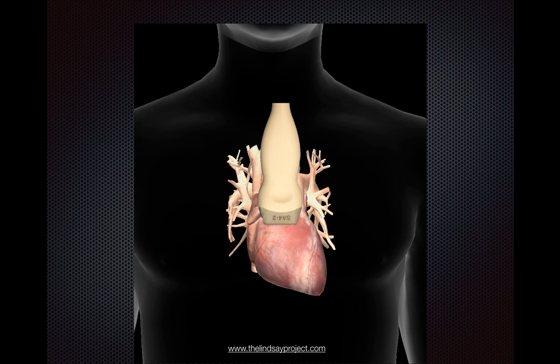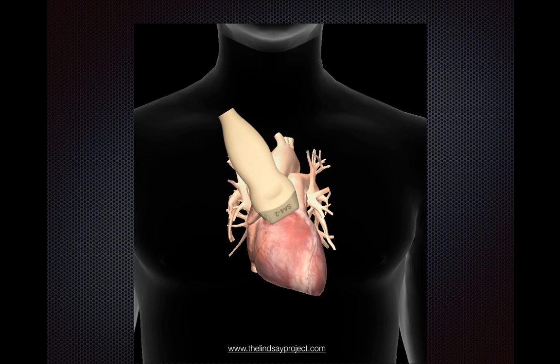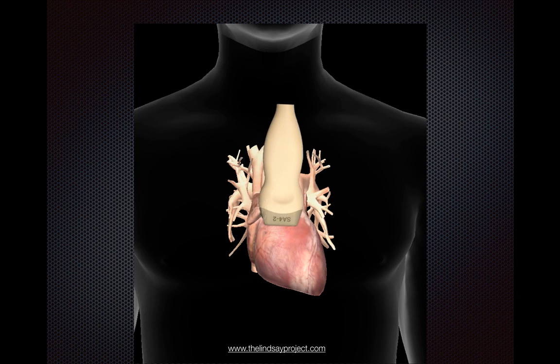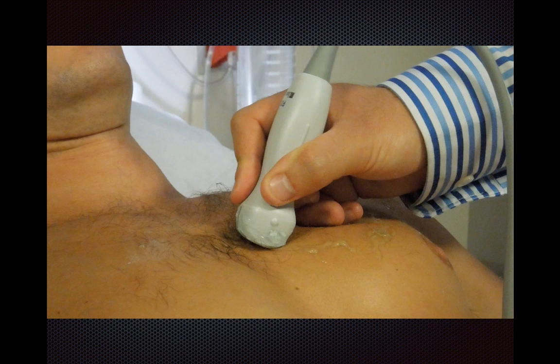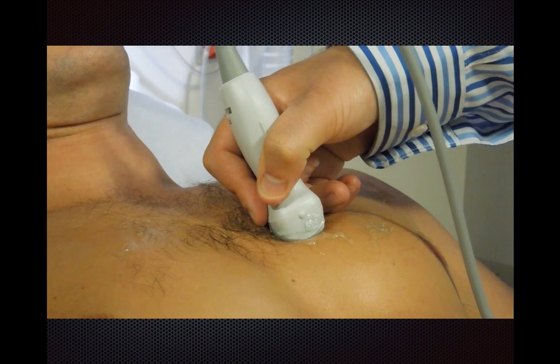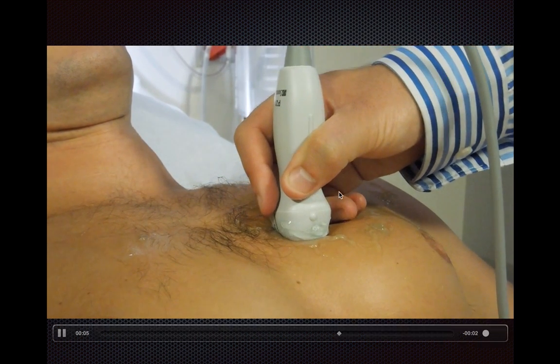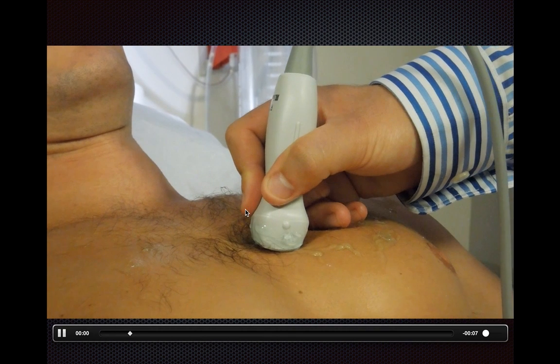For more advanced users, you may want to scroll through the heart to look at different aspects. You can tilt or angle a little bit towards the apex to look down towards the apical region, or alternatively sweep up and tilt your transducer to have a look at the aortic valve. Here we have tilting towards the apex and then tilting up to look at the aortic valve.